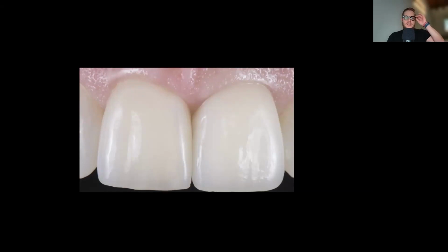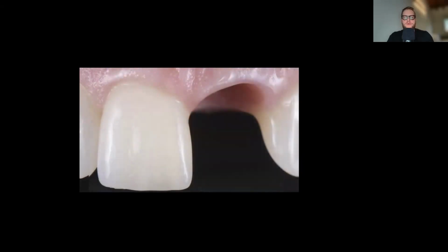So we can see this result that we were able to achieve with a single implant. And as you know, in some cases, it's easy to get this result. In some cases, a little bit more difficult. And ultimately it will depend on the anatomy of the patient and how they present themselves to the appointment, and what was their etiology, what was the problem behind the missing tooth.